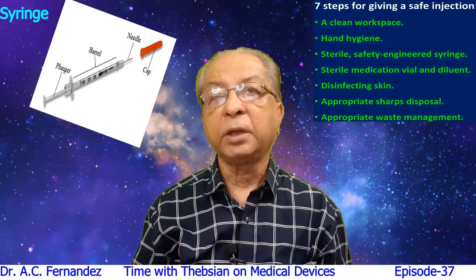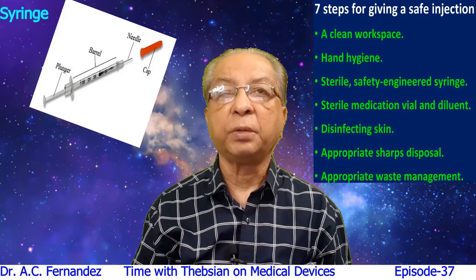That's all about syringes, but what about the needles? There can be needle stick injury for the patient as well as the person who is going to give the injection. He or she should not get needle stick injuries while attempting to give injections to a patient.